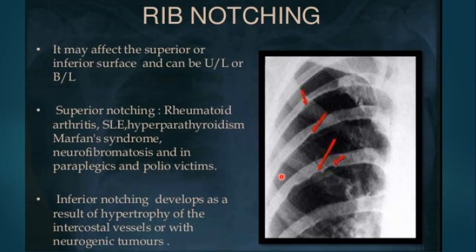So what is the answer of this question? Is it pre or post ductal coarctation? And of course, the answer is post-ductal coarctation. That means that the coarctation is after the anatomical location of the ductus arteriosus.